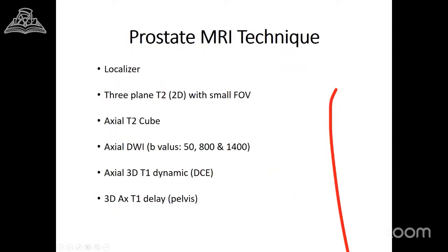So prostate MRI technique includes an initial localizer followed by multi-planar T2 weighted images using a small field of view.